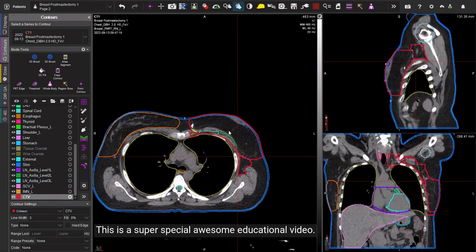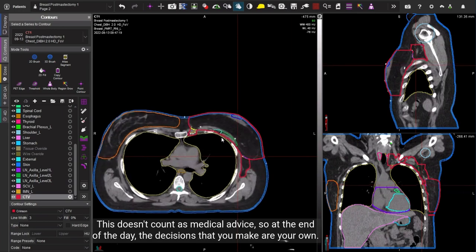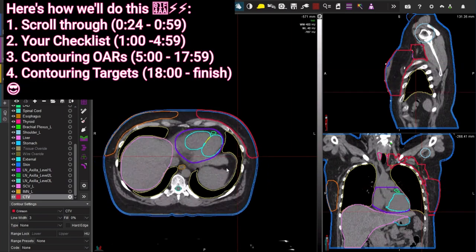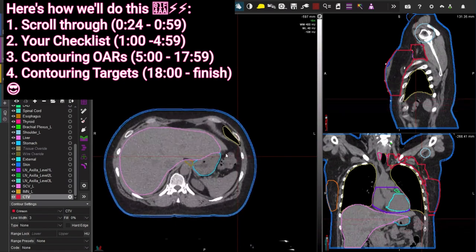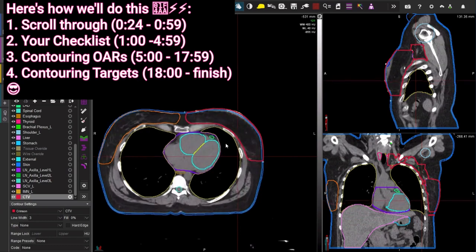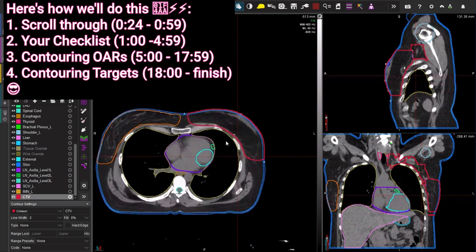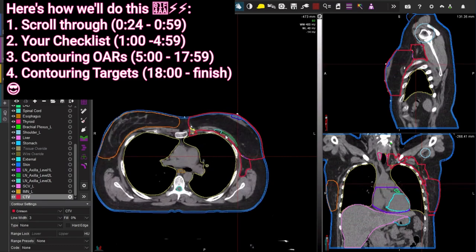This is an educational video. This doesn't count as medical advice, so at the end of the day the decisions that you make are your own. Regional nodal radiation can be quite a challenge, so that's why I wanted to focus on it. There are a few key details that you really want to make sure you get correct to minimize the chance of breast cancer recurrence in the patients that you're treating.